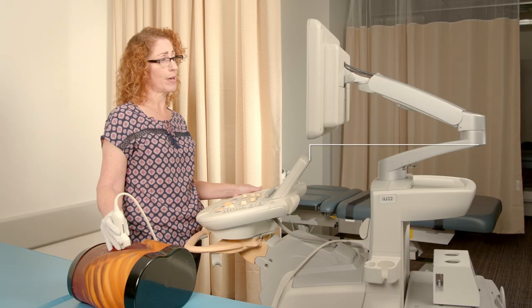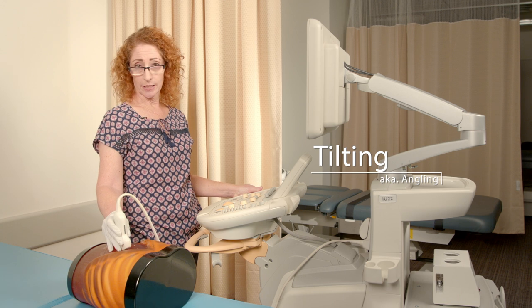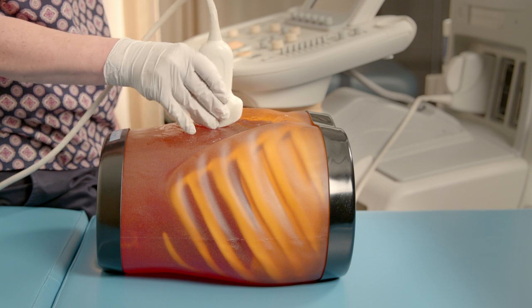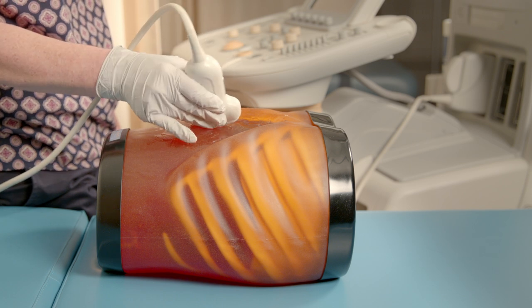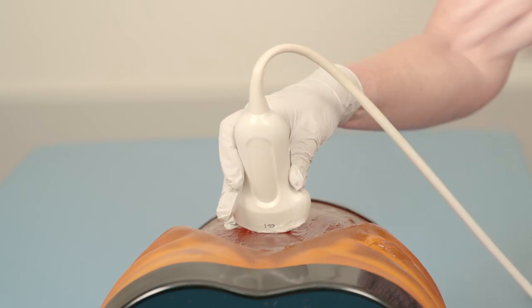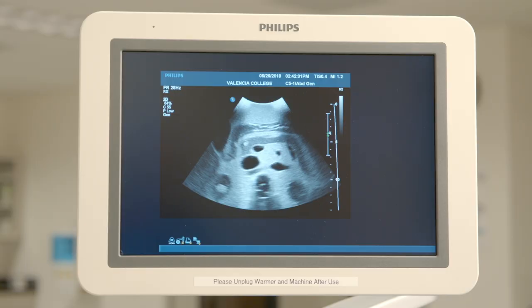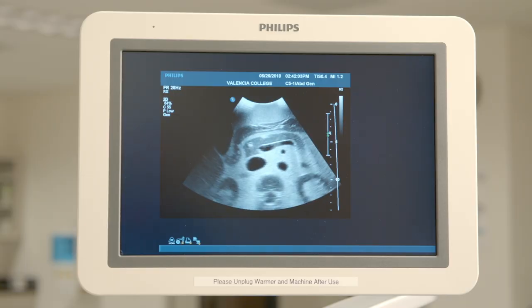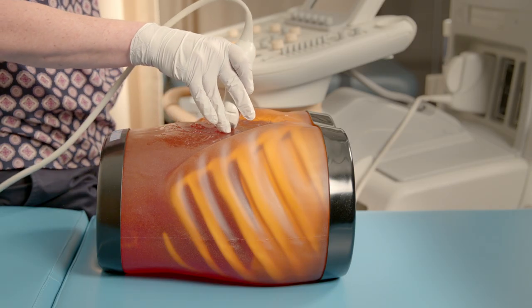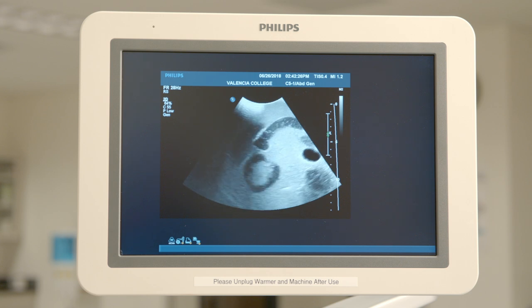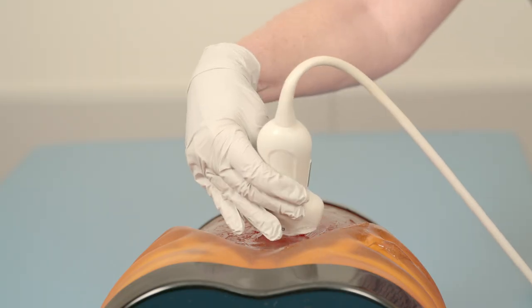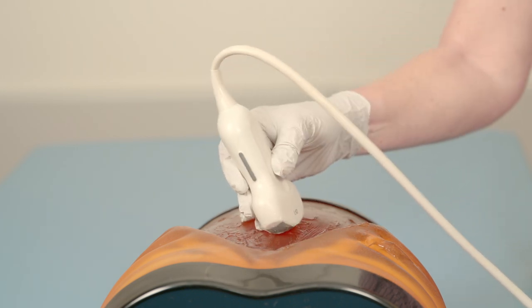Next I'd like to talk about tilting. Tilting and angling are sometimes referred to as the same thing, performed by tilting the transducer side to side or superior to inferior. This can be used to evaluate an entire organ by staying in the same acoustic window and simply viewing that organ from superiorly all the way through to inferiorly, or to see lateral through medial on that organ.